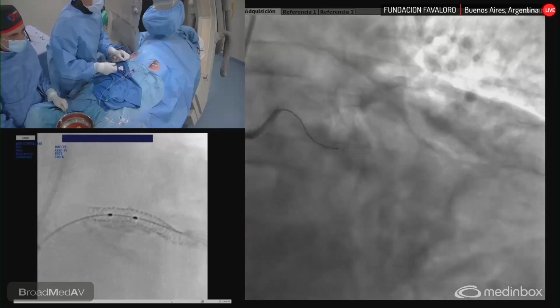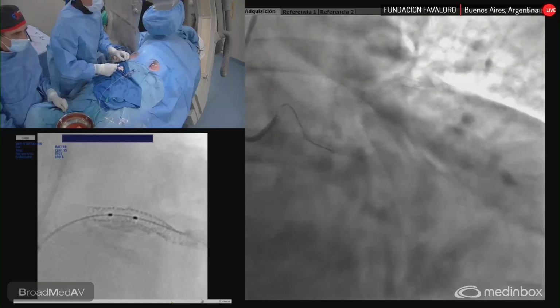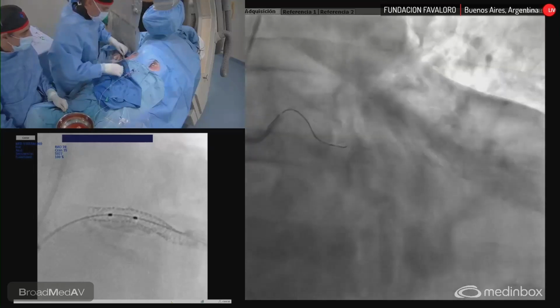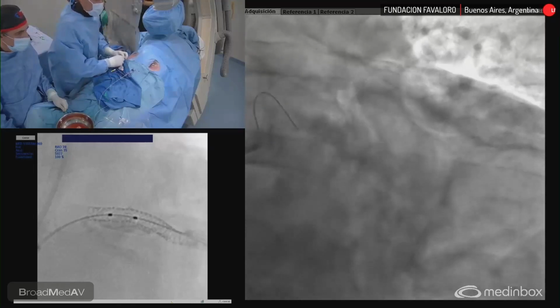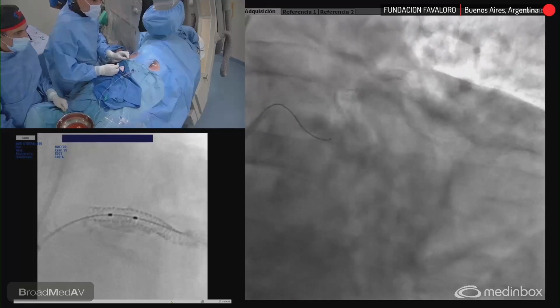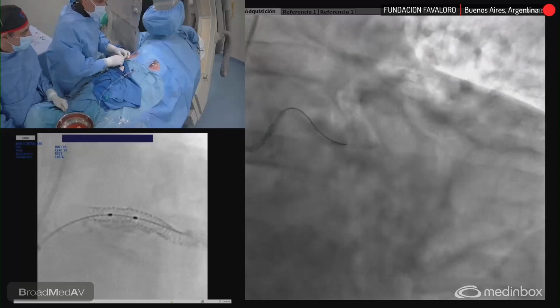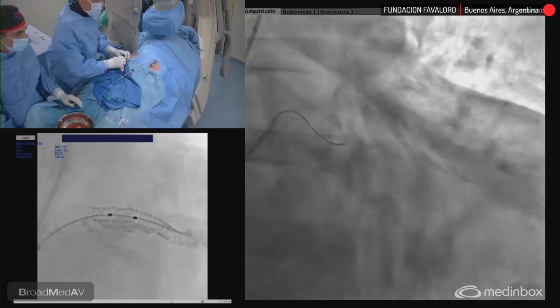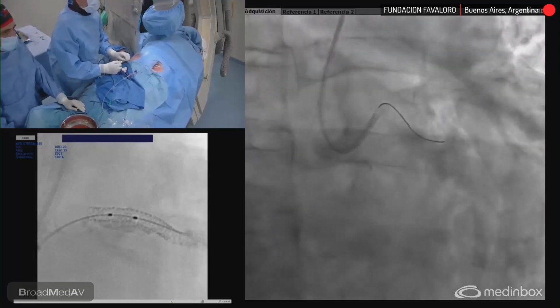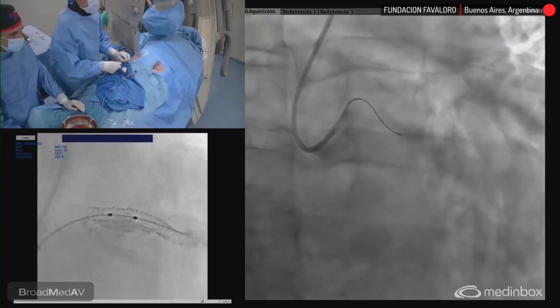So in this kind of plaques with severe tortuosity and calcification, which wire do you think will be the suitable? Well, we always try with the BMW from the beginning, but then probably Sion Blue is a good option. Fielder XT for tortuosity is okay. Hydrophilic wires could be, but you have to be very cautious about dangerous wires, especially when you are in a live situation. Dame un microcatheter. Let me see this.